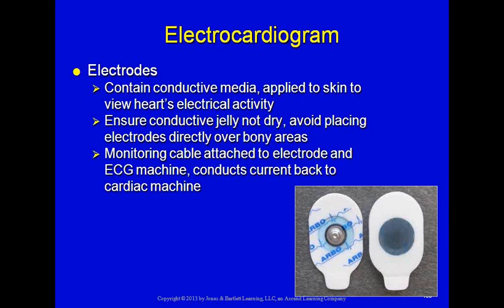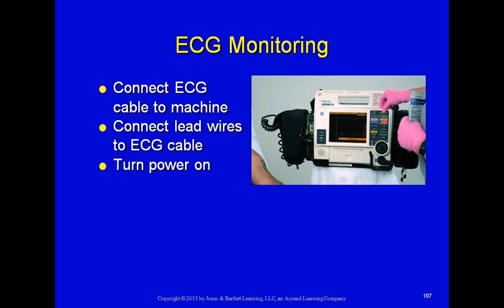And when everything's wired for sound, when you've got the patient hooked up to the electrodes, the patient cable plugged into the monitor, and the monitor turned on, you'll be able to measure the electrical activity that's occurring in the heart. And we do this with an ECG monitor, and one of the skills that you'll be practicing in your lab would be hooking up a heart monitor, whether you're using 3 leads or 4 leads or 5 leads or even doing a 12-lead ECG.